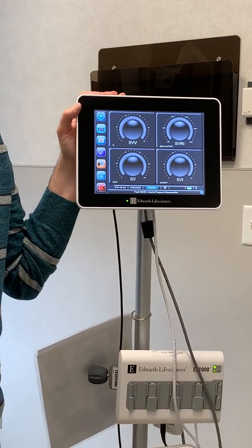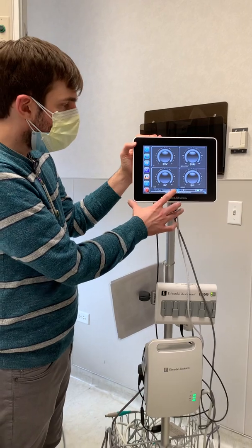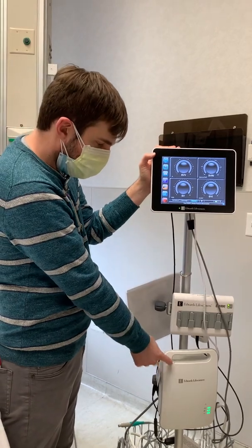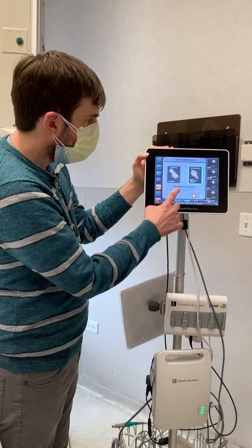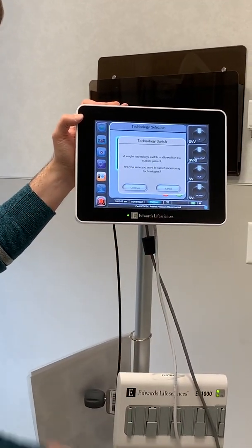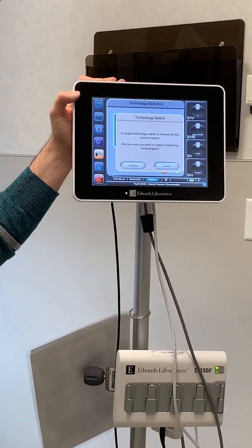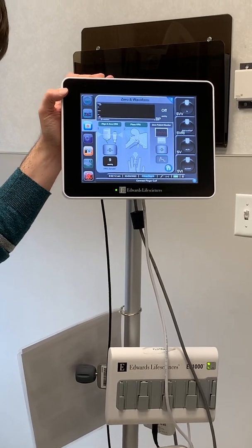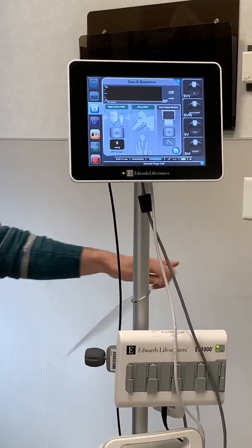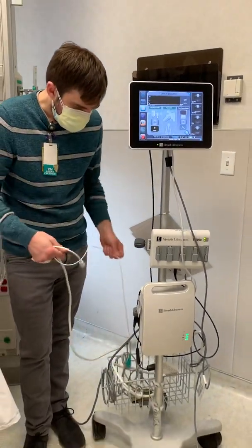If you want to do it with the finger cuff, the doctor may ask you to set that up as well. When you turn it on, it says FlowTrack at the bottom. If we want to do it with the ClearSight, we have to hit FlowTrack and change it to ClearSight, then hit the enter button to continue. It's going to ask: are you sure you want to switch? Hit yes and continue. This part is a little bit not as user-friendly as the other, so I always refer to the guide.